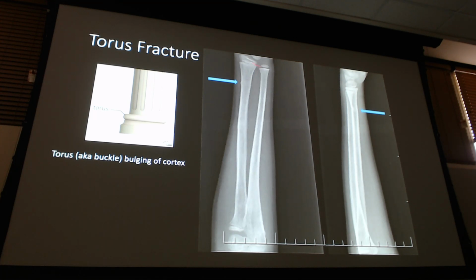And how do I know it's peds? Again, I got my growth plates. So that's what I'm saying, if I give you peds x-rays, outside of Salter-Harris, I'm not looking for you to be able to distinguish between, is that a fracture or is that a growth plate? But within the shaft of the bone, that doesn't matter, peds or not, right? You're knowing that that's an abnormality there. Because this is too difficult for you guys to tell me if that's a growth plate or just a fracture.